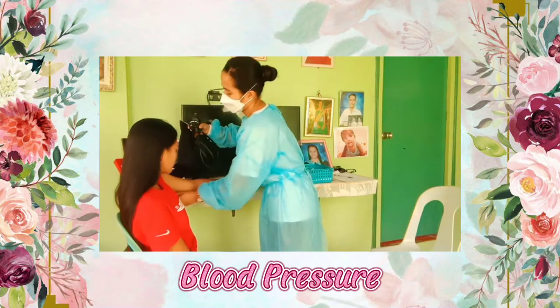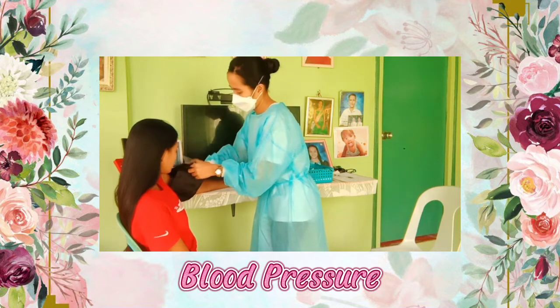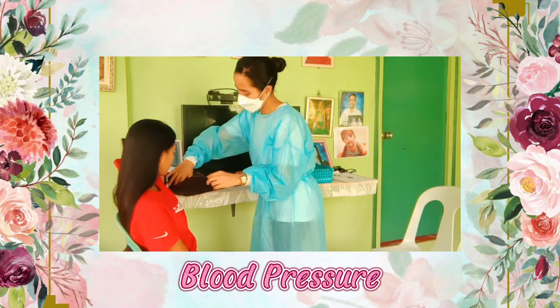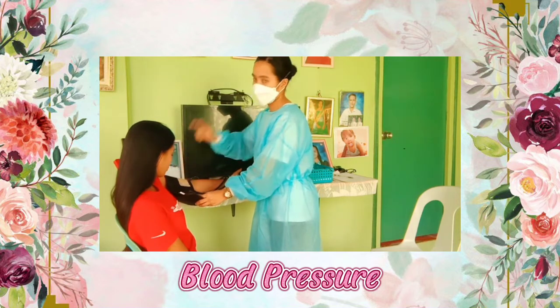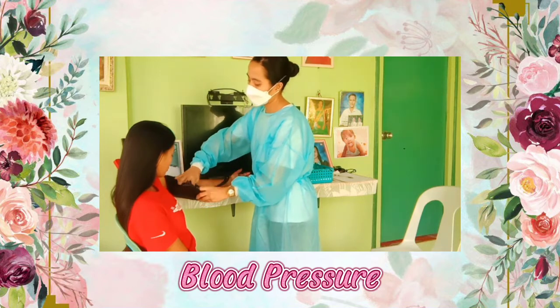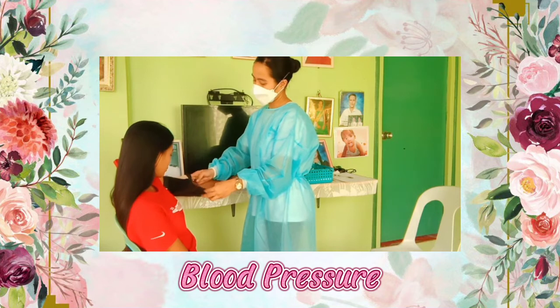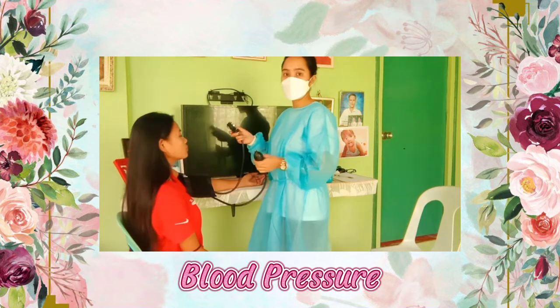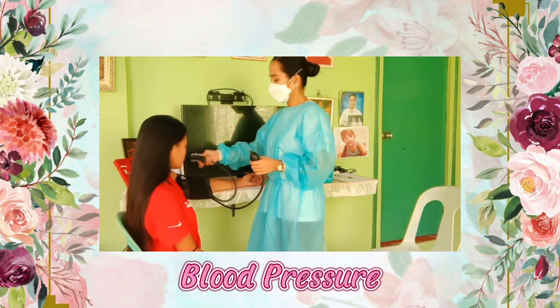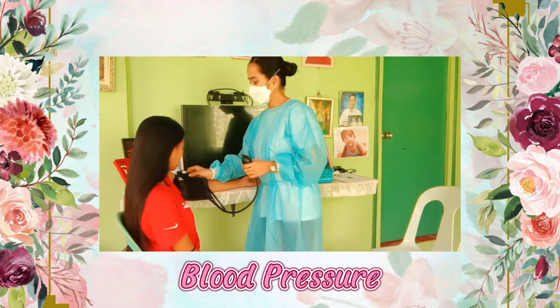With the cuff fully deflated, apply the bladder of the cuff above the artery by centering the arrow mark on the cuff over the artery. Position the cuff 2.5 cm above the site of pulsation. Use 2 fingers to make sure that it's not too tight or too loose. Position the manometer gauge vertically at eye level and no farther than 1 meter away.